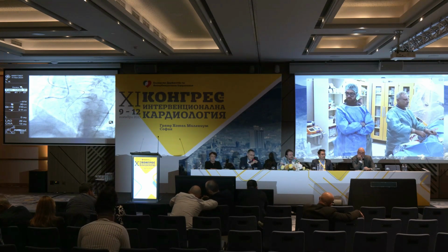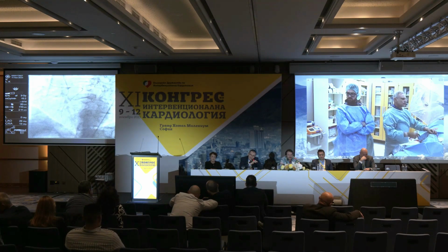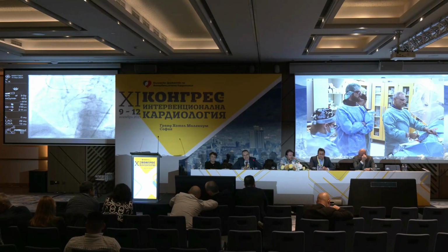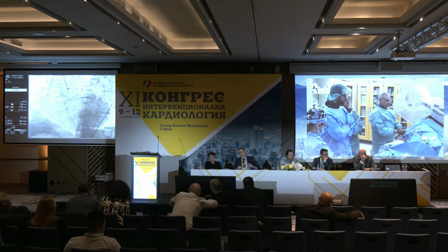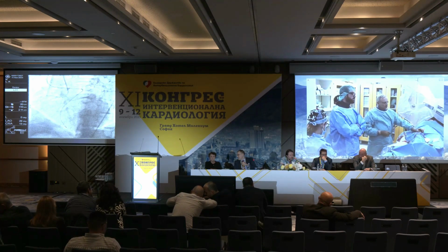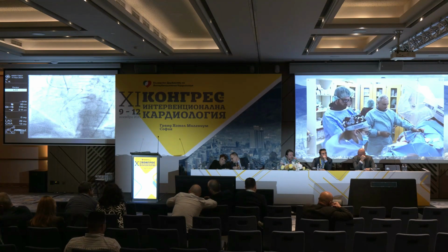So, guys, you have 33 minutes till the end of the session. So it will not change the strategy, but feel it. No, we have two reasons: just to see the vessel size, advance a little bit more, and the second thing is just to evaluate the ostium, because we are not sure where exactly we made the reconnection. But it's a good point, Dr. Gelev. We don't know where the reconnection happens, whether distal, at the proximal cap, or maybe a little bit more.